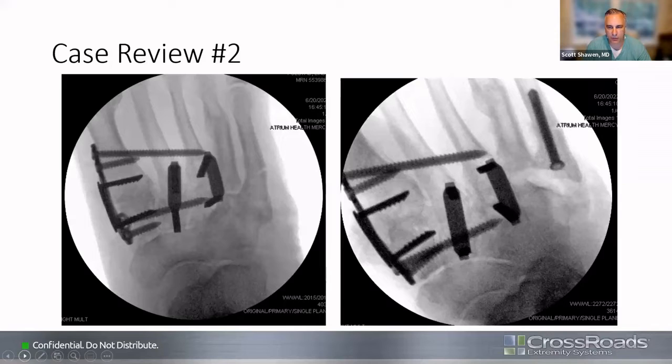But we came in with freehand cuts and cut the second and third metatarsals, came back and did a dynabunion on the first, and then we're able to reduce that and hold those metatarsals in place. We then came back and resected the base of the fourth and the fifth in order to allow that portion of the foot to rotate over and up.